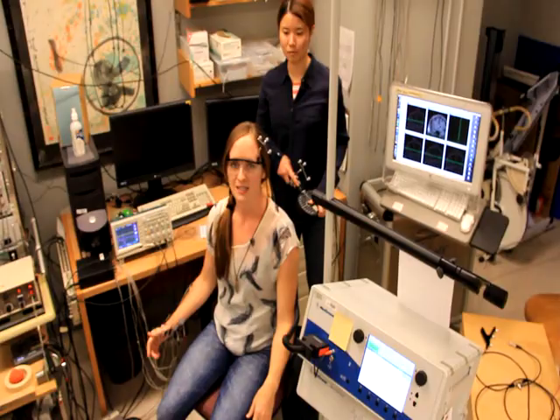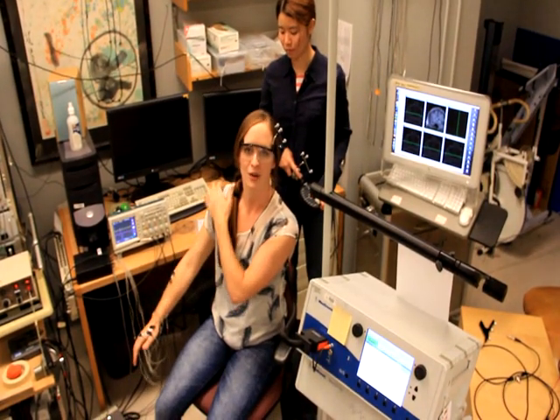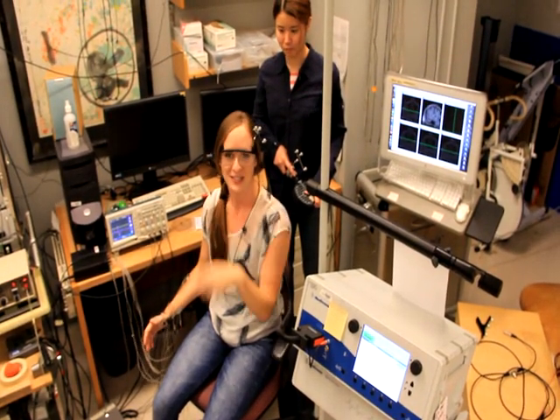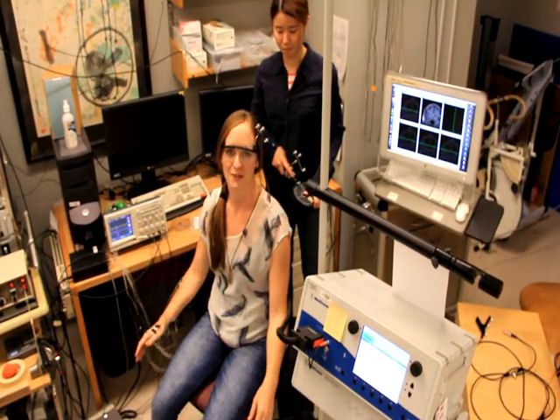What you'll see is muscles slowly recruited from my hand up to my elbow, shoulder, and right leg. And after she switches hemispheres, we'll see some of the left leg come in and then down the muscles of my left arm.